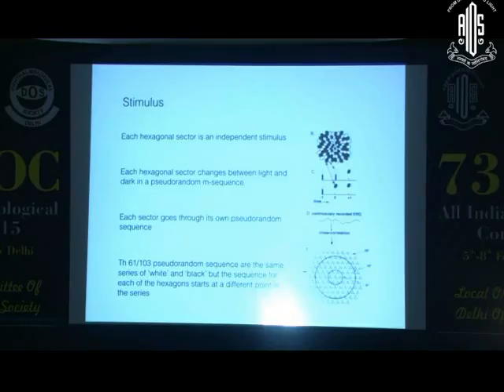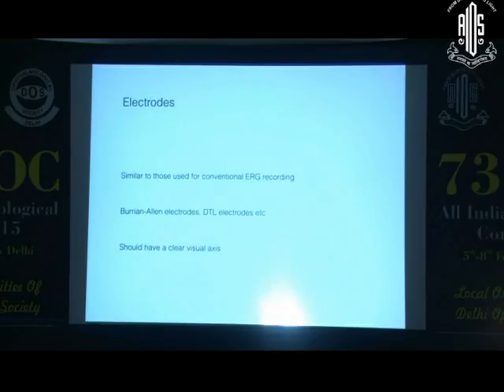The entire response is graded, and you get one continuous ERG waveform, from which, depending on the sequence, the machine mathematically derives the responses from each hexagon, the waveforms from individual areas.